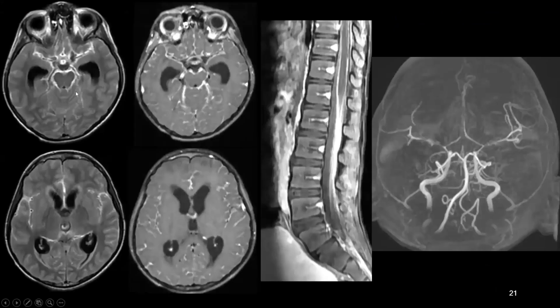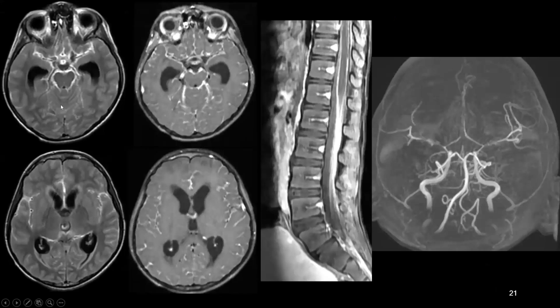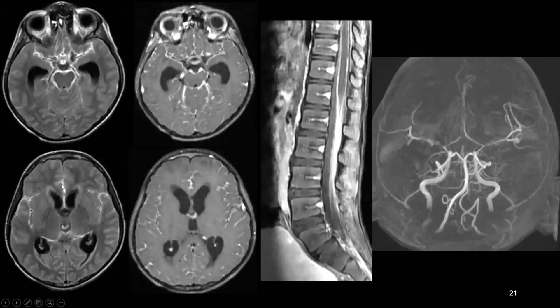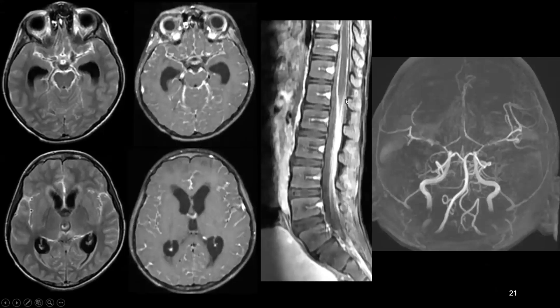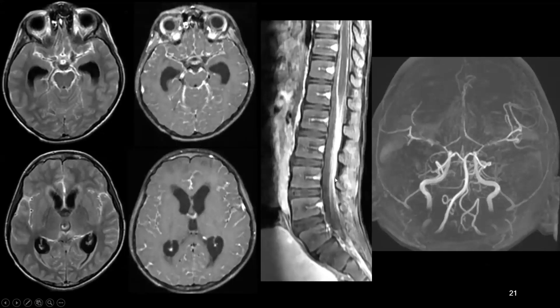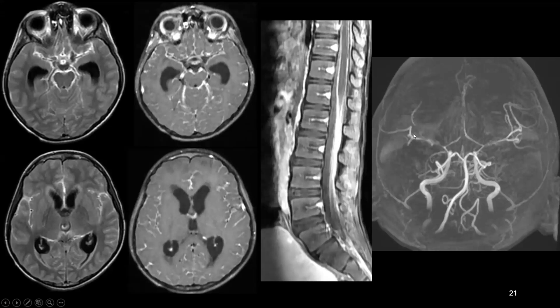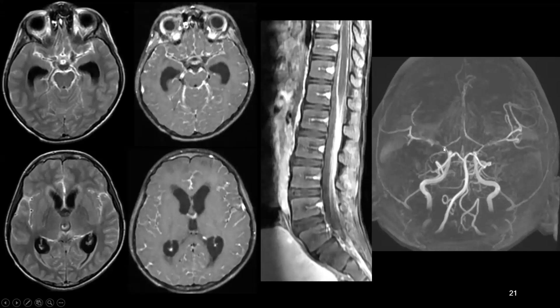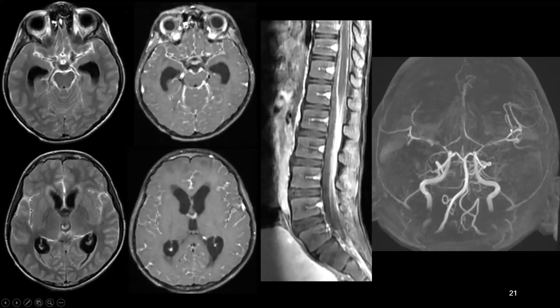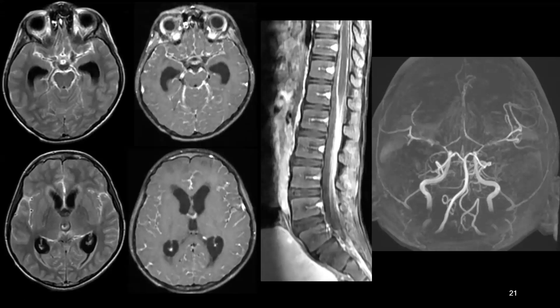The same patient now undergoing MRI — you can see the diffuse leptomeningeal disease with basal predominance and enhancement of the cranial nerves. On spine imaging, there is thickening of the cauda equina nerve roots; they clump together and are enhancing. On TOF MRA, there is diffuse severe spasm of all the vessels — the M1 and A1 segments of the ACAs are all in diffuse spasm.